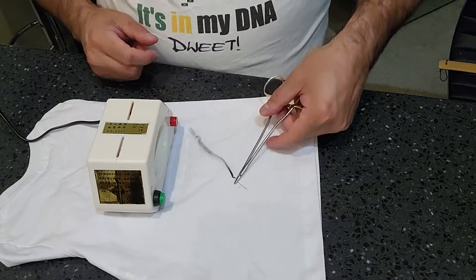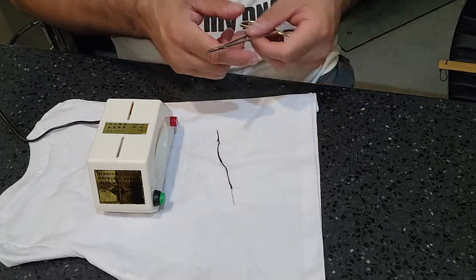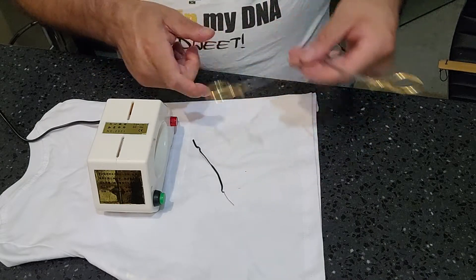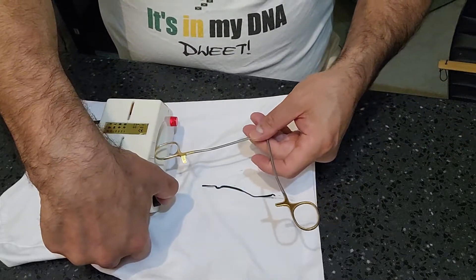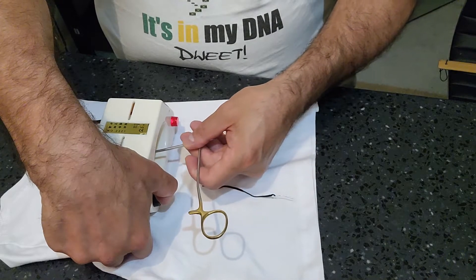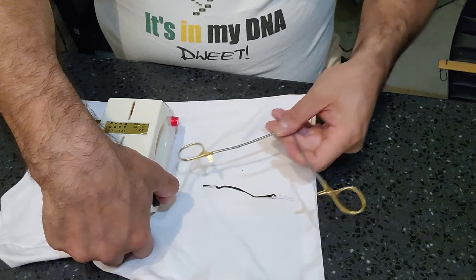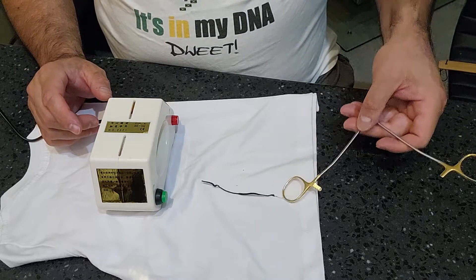More importantly, the tip isn't magnetized. Needle drivers are the ones that we definitely want to demagnetize. And like I said, it doesn't take long to demagnetize it. You want to go ahead and go through — and again, you don't want to touch any of the actual plastic. There you go — it's demagnetized.